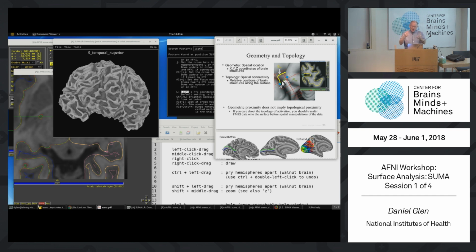That said, you still have to get the volume onto the surface in the first place, so you make decisions there of how you do that. A lot of people don't really think about that process. It is a process that does move things from the volume onto the surface, and then if you're going to move it back to the volume, you have to make choices there too. And there are lots of other issues. This goes on and on, just like I'm doing right now.